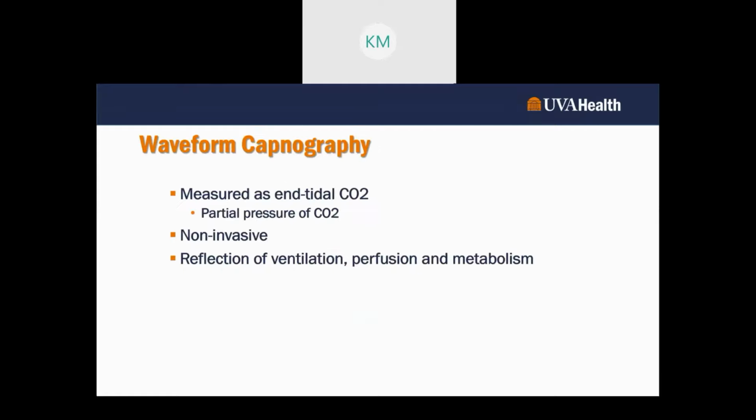So what is end-tidal CO2? Well, let's talk about end-tidal CO2 in this waveform capnography. Waveform capnography is measured as end-tidal CO2, and what we're really looking at is the partial pressure of CO2. This is non-invasive, which is fantastic, right? We try to limit the amount of invasive procedures that a patient will need during their care, and this is reflective of ventilation, perfusion, and even metabolism, and we'll get more into those aspects in later videos.